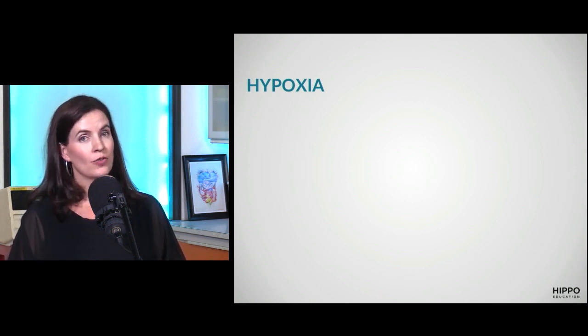And so when we look at common problems that lead us to adjust, we need to know what changes to make on the ventilator for these problems. So say I've intubated Paul. Poor Paul got intubated today. And we set his initial settings, and that was going pretty well. We put him on volume control, and my plateau pressures were less than 30, so I was happy. But Paul is hypoxic. His SAT is not acceptable. Say his SAT is 85, and we're worried about Paul's brain.